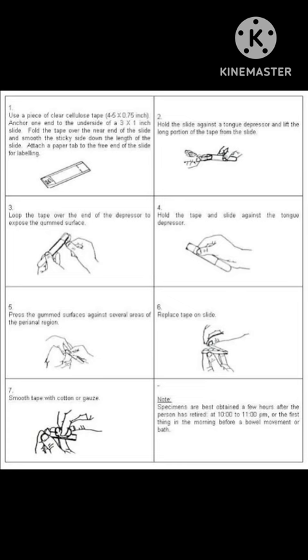This is the summary of the step-by-step process. There are also additional procedural notes: specimens must be obtained either a few hours after the patient has retired — so around 10 or 11 p.m. at night — or first thing in the morning before the patient has taken a shower or done their bowel movement. We have to make sure that the patient has not washed or performed personal hygiene yet before collection.